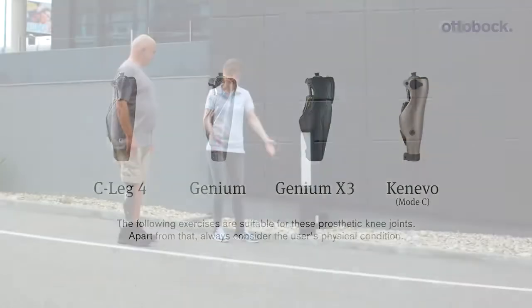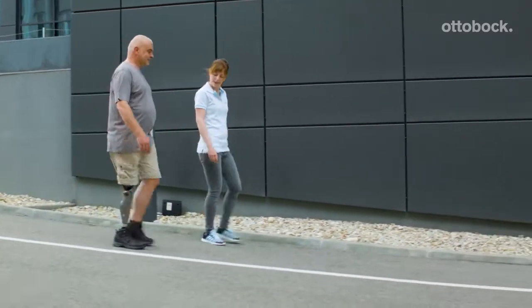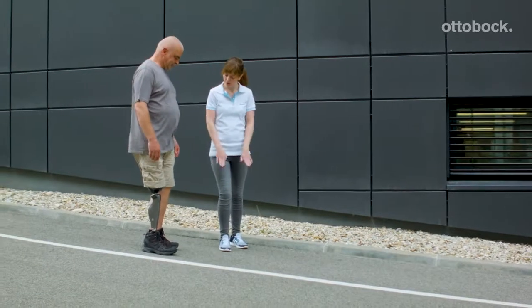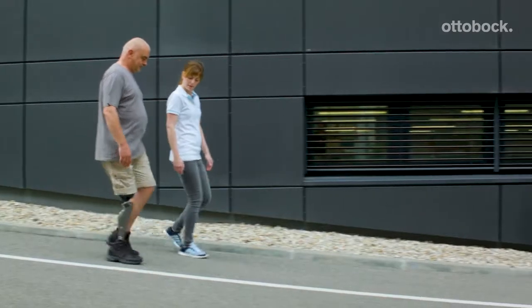The previous exercises are put into practice outside. Gerhard shows us uphill walking, downhill walking with different gait strategies, stopping and the stance function. When choosing exercises, take into account the user's training level.